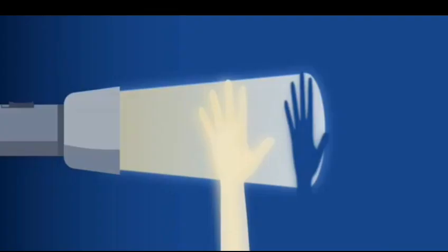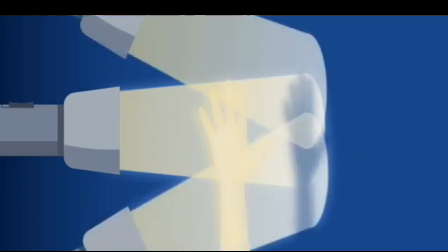Compare this process to how you can use a flashlight to make a shadow of your hand. Some of the light is absorbed by your hand, and some of the light transmits past your hand. The combination of absorption and transmission is what creates that nice high contrast shadow of your hand. Now imagine what would happen if we added other light sources that are out of alignment with the flashlight. These other light photons add light to the image, but this added light actually degrades the visibility of your hand. Scatter radiation is like this. Scatter radiation adds useless information to the image and degrades the image quality.